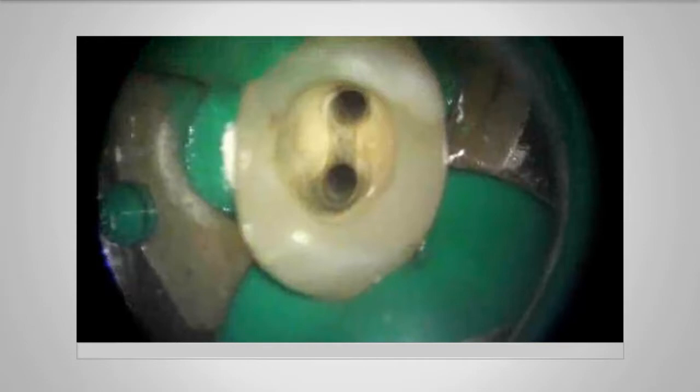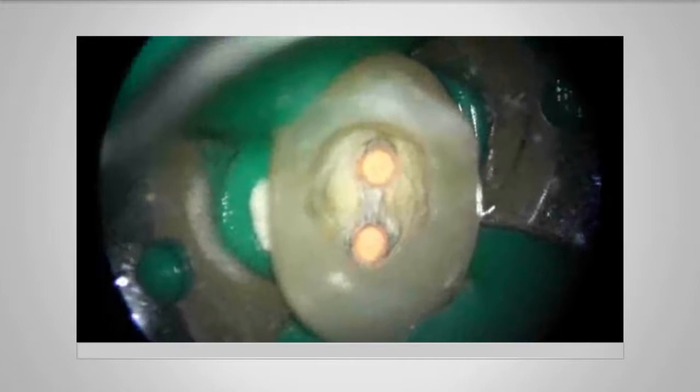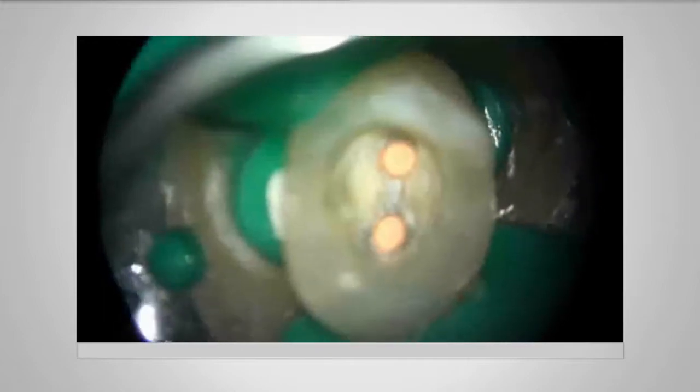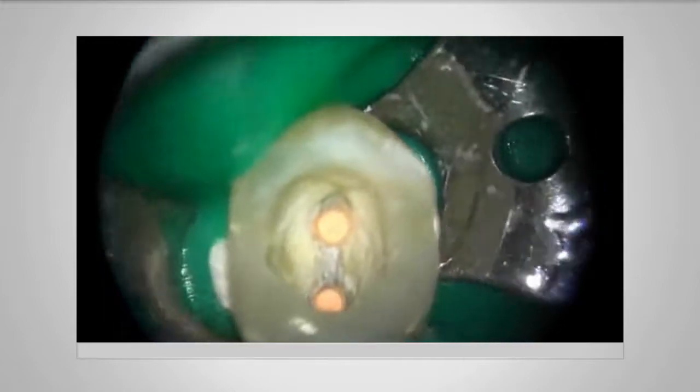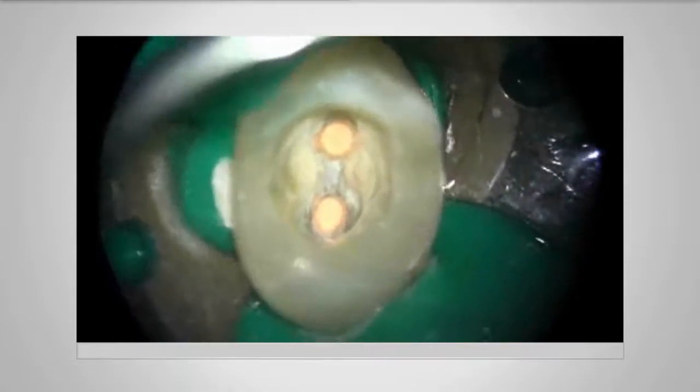So that's the prepared root canals, nice and conservative. There they are, obturated. And then in a minute we should see the completed root canal treatment.